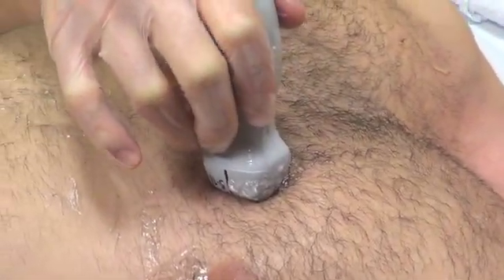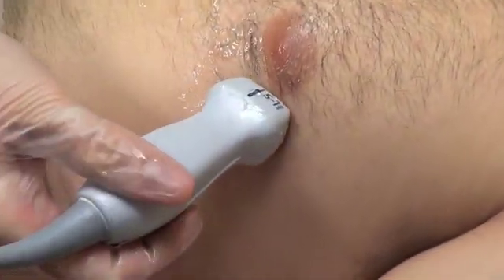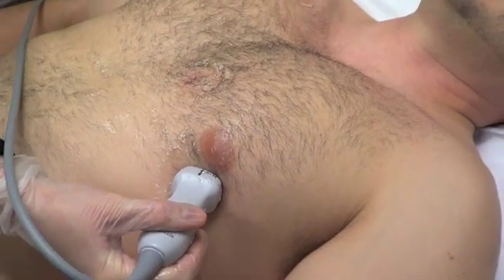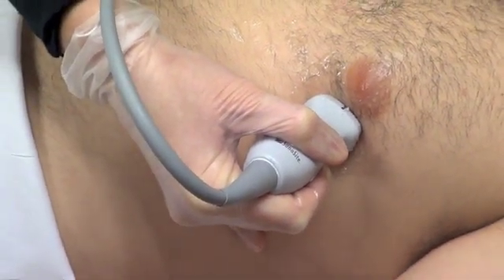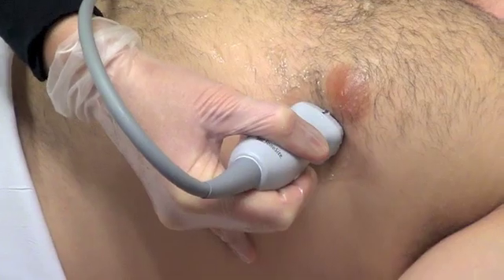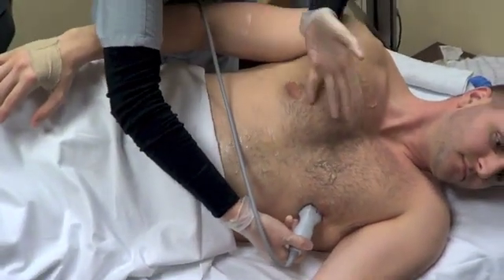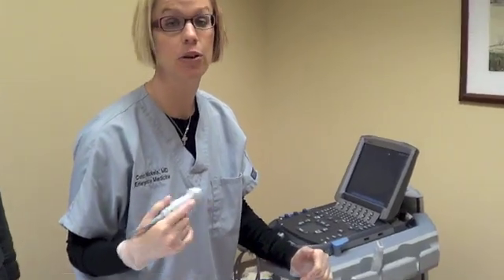After the short axis view, we go to the four-chamber view, which is at the point of maximal impulse — the PMI. You want the indicator towards the patient's left axilla down towards the bed, looking up towards the patient's right shoulder. Most of the time our patients are supine and can't be rolled, but if we're able, we can have the patient roll onto their left side. This brings the heart closer to the chest wall and allows a better view. We see this a lot with COPD patients, obese patients, and patients who've had lung resections.